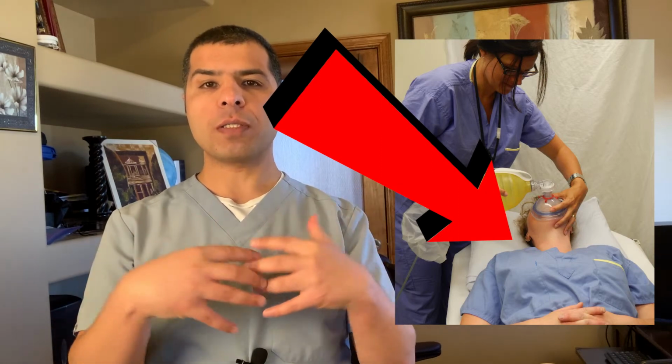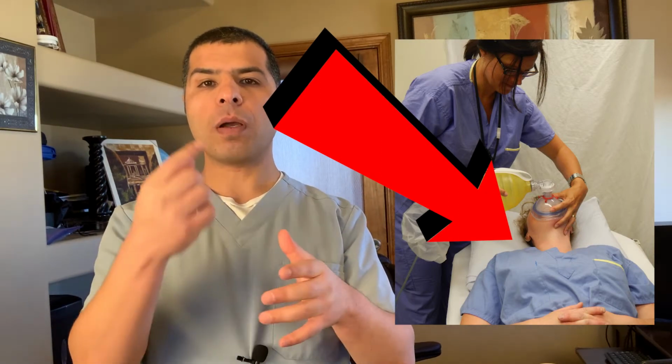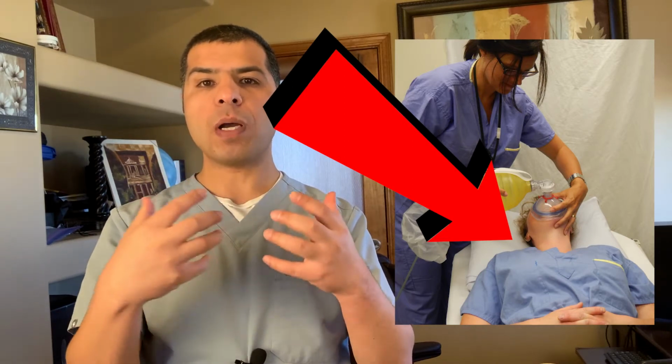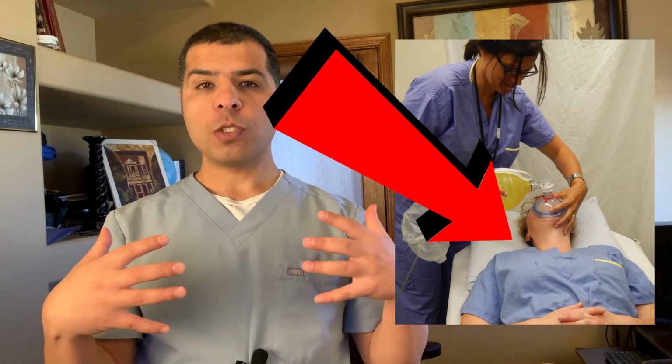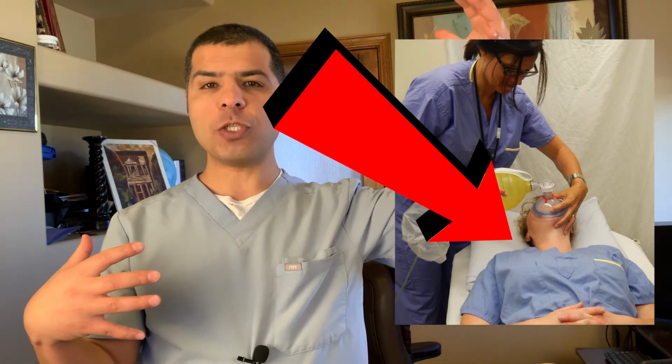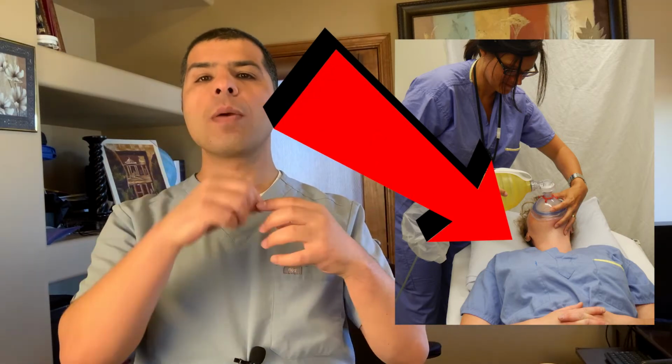When I start bagging them, I make sure I keep my eye on, or as I said, assign somebody to update me on the oxygen saturation. And I keep my eye on their chest. I need to see a good chest rise. One of the complications that can happen is that the patient can block their airway with their own tongue when you sedate them or when they are severely obtunded. So if the oxygen saturation starts coming down, you don't see good chest rise, immediately open their mouth and open their airway and move their tongue.